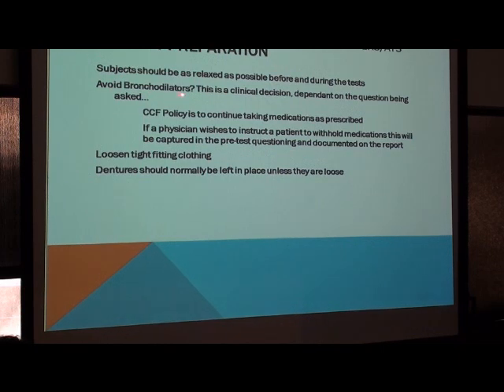And I will acknowledge that at some point in time you do want the patient to be clean, off medication, and see what their bronchodilator response is, but more for that patient where you're really questioning whether asthma is present or not, and their lung function is really not all that bad. But to have a blanket policy where you say all patients withhold medication really ignores the fact that some of those patients are highly dependent upon continuing that regimen, and you really don't want to disrupt it.